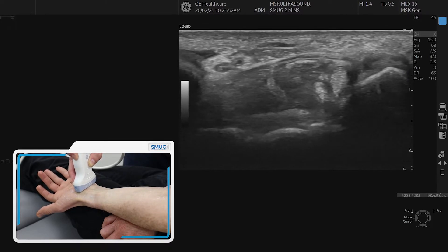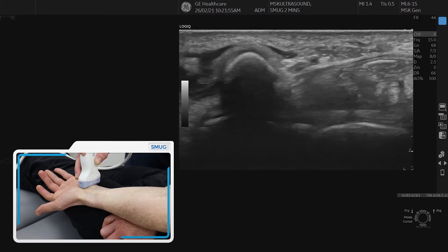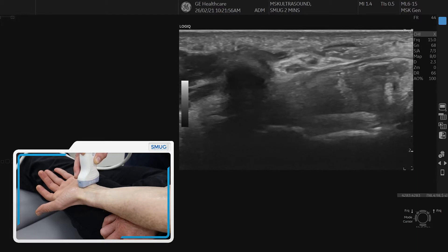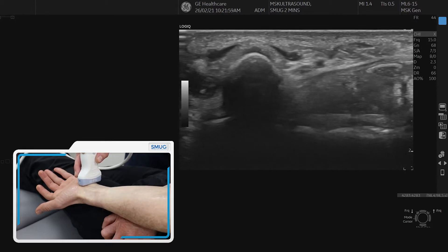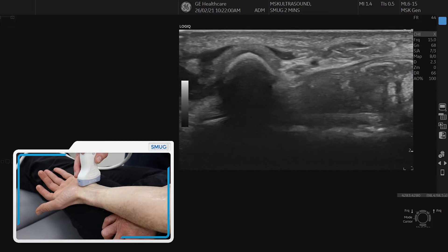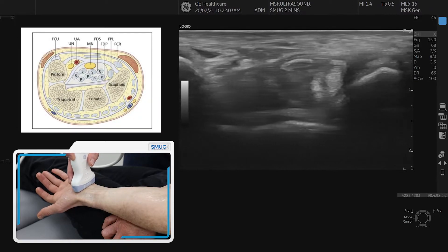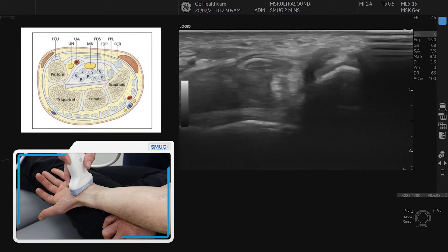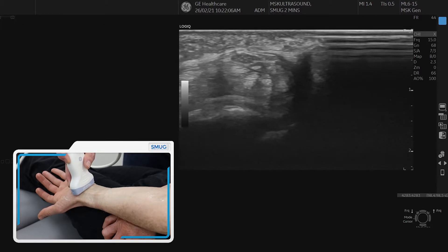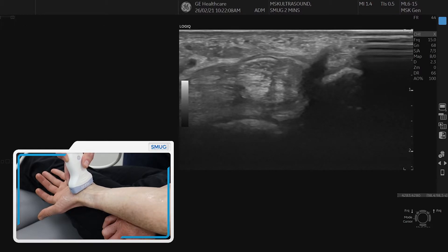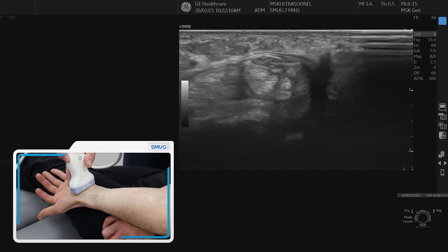The ulnar side is on the left side here. We can identify Guyon's canal — it has an artery, vein, and nerve in that little compartment. We can see the retinaculum all the way to the radial side, and then we identify the median nerve again going into that compartment.